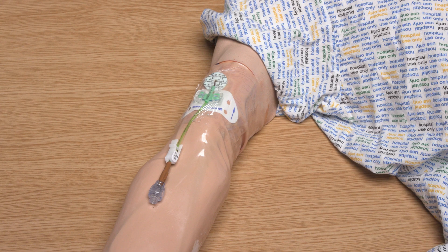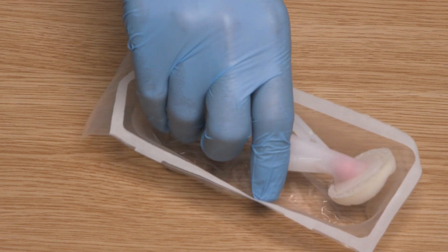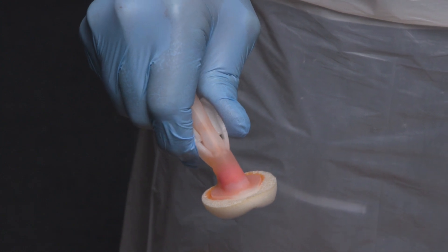It is important that before I begin to remove the PICC dressing I ensure the patient is positioned comfortably with their arm extended and palm facing upwards, as this will reduce the risk of the catheter migrating during the procedure. Using the wand that is being protected in the microcritical aseptic field, tilt the wand in a downwards direction and gently pinch the wand wings until you hear a crack. Allow the 2% chlorhexidine and 70% isopropyl alcohol solution to saturate the wand sponge.